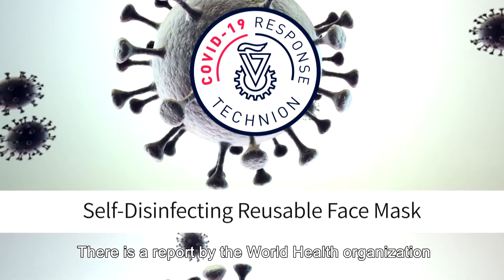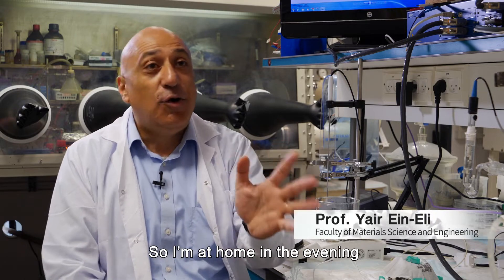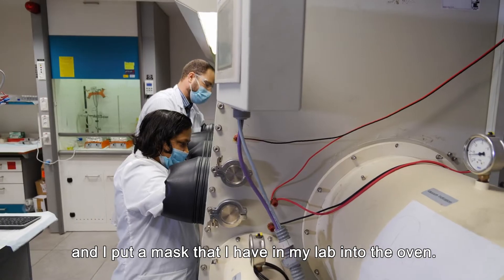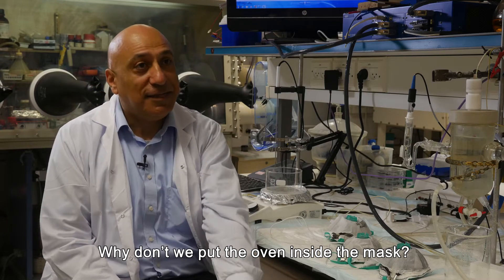There is a report by the World Health Organization stating that 56 degrees for 15 minutes is more than enough. So I'm returning home in the evening and putting a mask that I had in my lap into the oven. But what happens if you don't have an oven in your office? What would you do? Why won't we put the oven inside the mask?